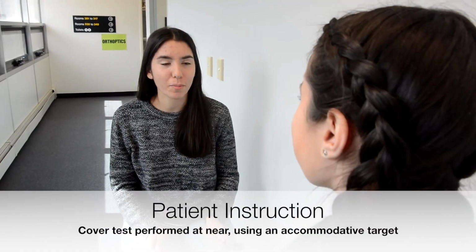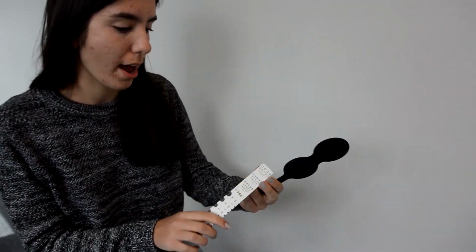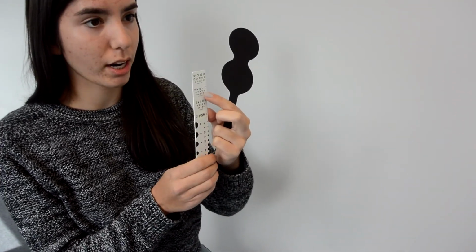Now we will observe all three components of the cover test being performed on a patient at near using an accommodative target. Today we're going to be doing a cover test, so I'll be covering and uncovering your eye with this occluder here so we can determine how well your eyes are working together. Okay, so we'll just start off by having a look at this target here. So what's the lowest line you can read?